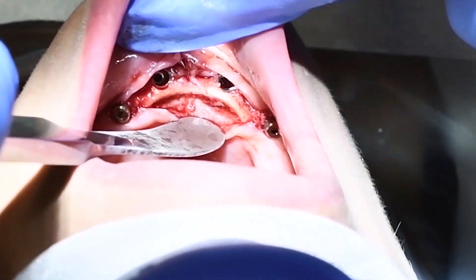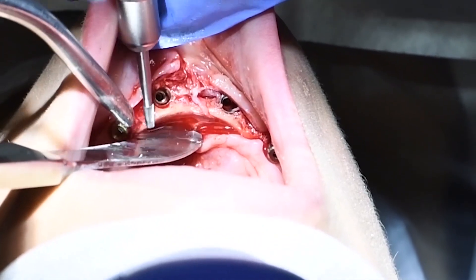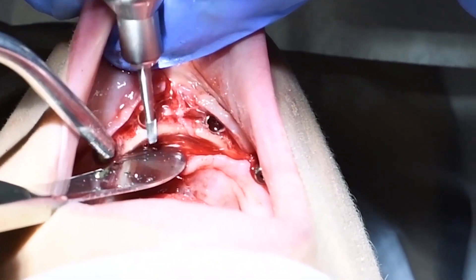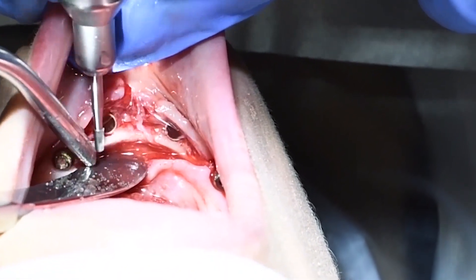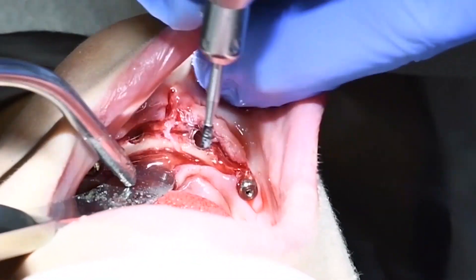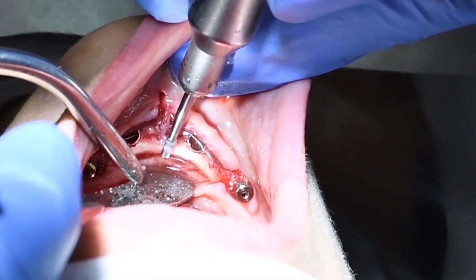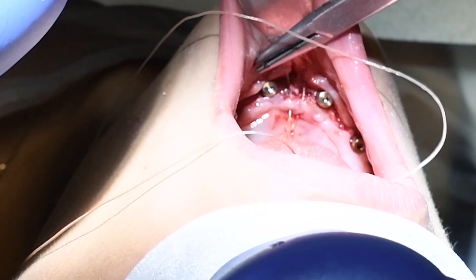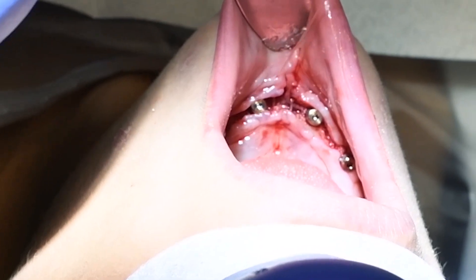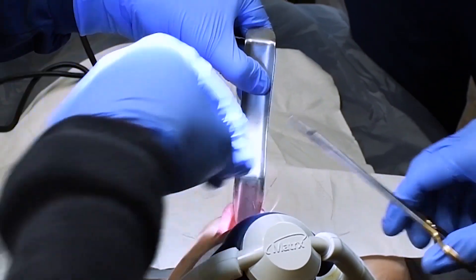Now if we retract the tissue on the inside, the bone is sticking up high, so I'm using the burr to reduce the vertical height of the bone on the tongue side — what we call the lingual aspect. I then put some generic metal discs called healing abutments on.